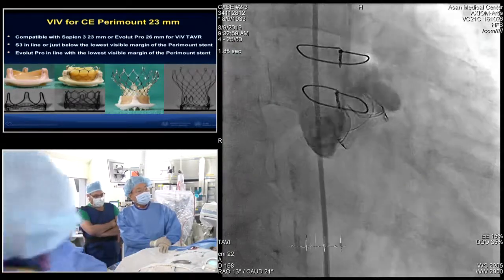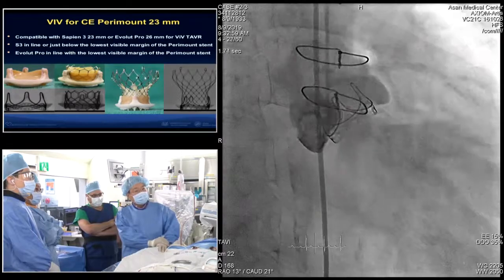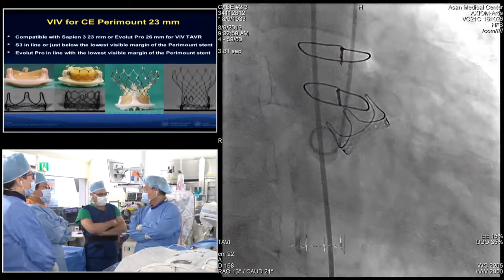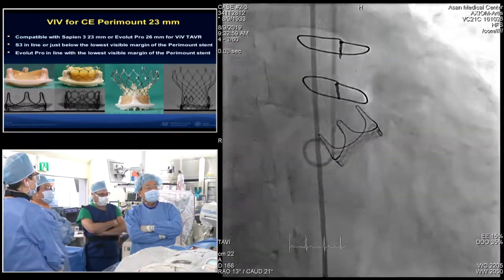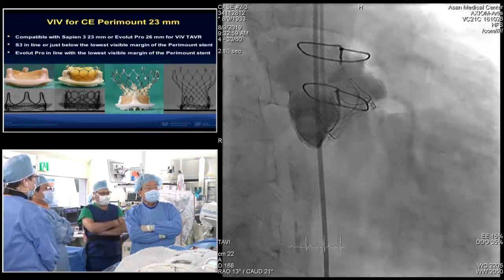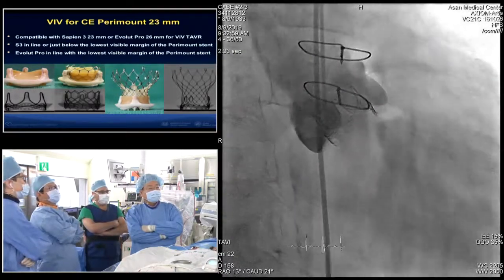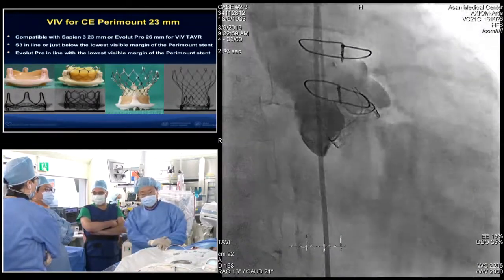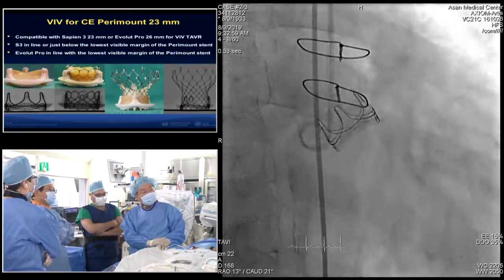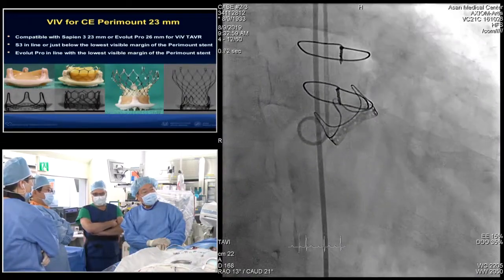The one thing I would just comment on, it's not a question here, is when you do have a valve where the predominant failure mode is regurgitation, it is, I think, important to do a TEE beforehand to make sure it's not a paravalvular leak. I think that was done in this case, because we've sometimes been fooled, and we treat for central regurgitation, and it turns out we needed to plug a PVL. So I think that's important when it's aortic regurgitation, just to be sure. I think it's not much of a question in this case.